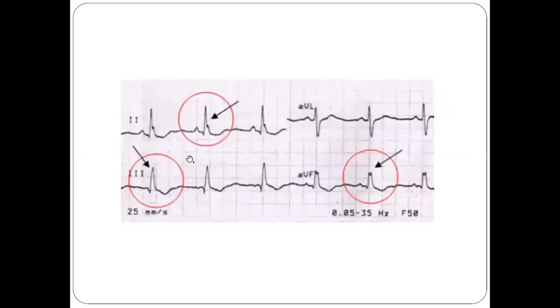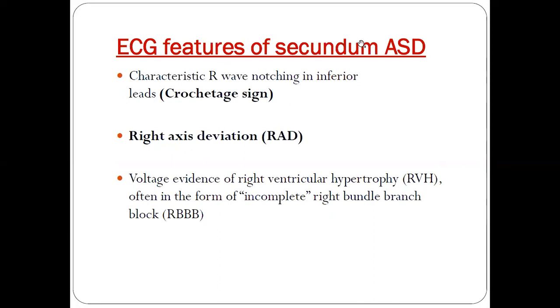You can see here notching at the tip of the R wave — notching in leads 2, 3, and aVF. This is suggestive of the Crochetage sign and is suggestive of ostium secundum ASD with a large defect and a good amount of left-to-right shunt.